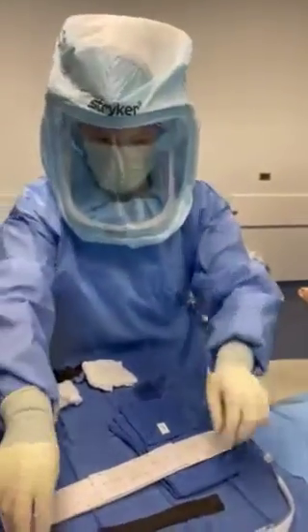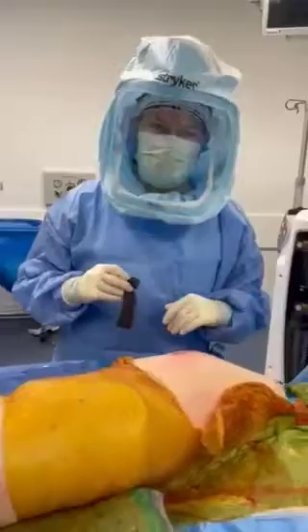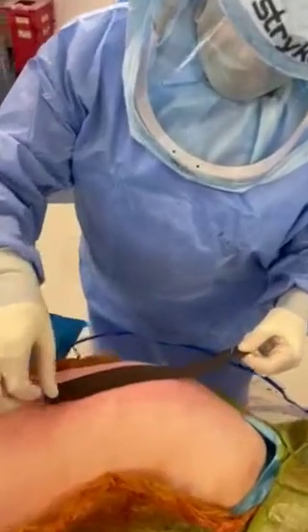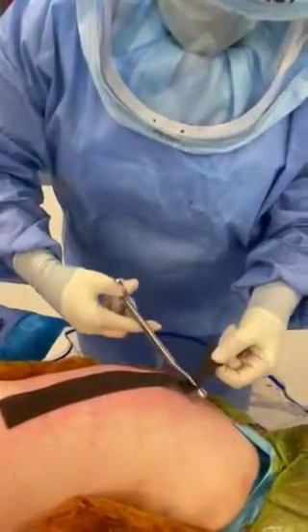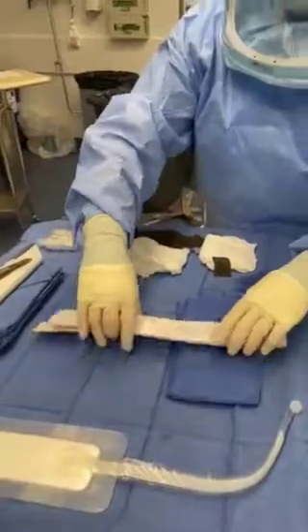All right, so now we are to the application portion of our PICO. So I have cleared a clean, dry area over the incision here. We actually use the Acticoat under as well. So this is the silver that we'll put underneath. I just cut it to size. Perfect. Come back to the mayo that our scrub nurse has set up very nicely for us.